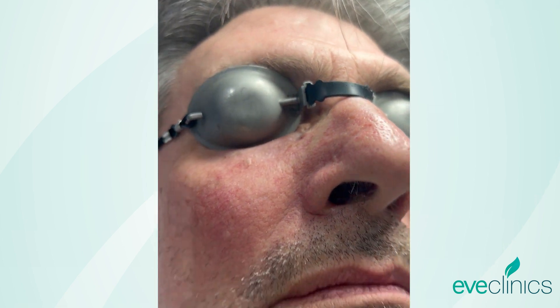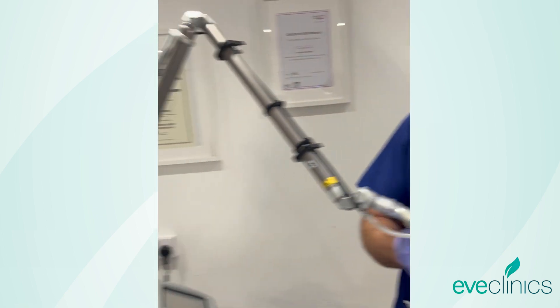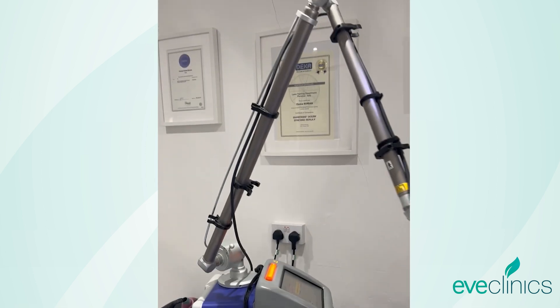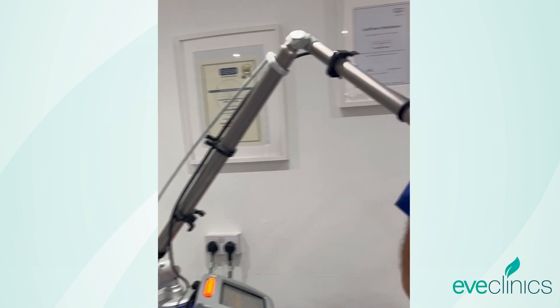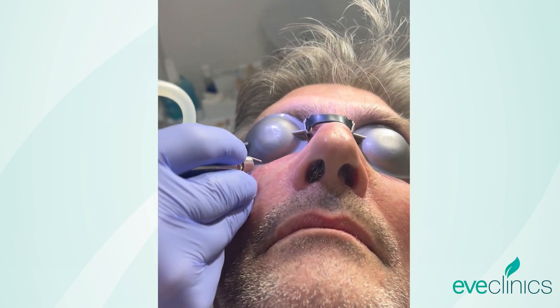The next step is just to use our ablative laser system. Ready to rock and roll. So I'm just going to start with this one — give you a little trial.